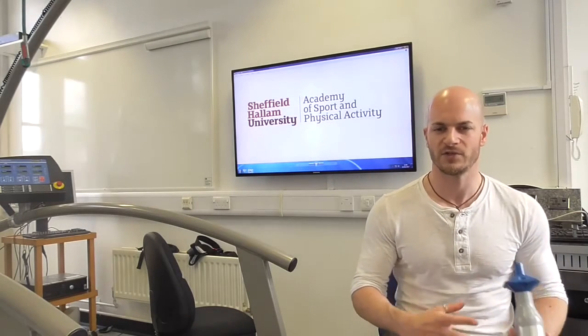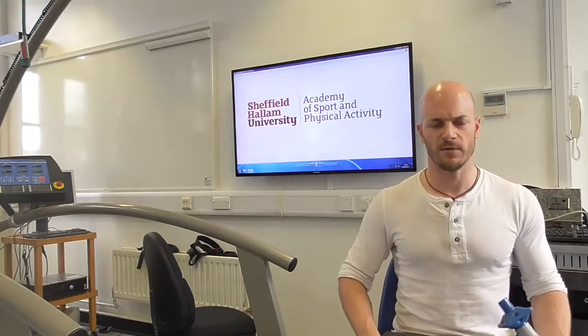After three or four breaths, whenever you're ready and in your own time, take a maximal breath in to the top of your lung capacity — really inflate the lungs as deeply and as fast as you possibly can. Don't forget that the more you breathe in to begin with, the more air you can ultimately breathe out. So really make a conscious effort to inspire as maximally as possible, inflate the lungs and the rib cage. Then, with a pause of less than a second, blast all the air out of your lungs as hard, as fast, and for as long as you can.